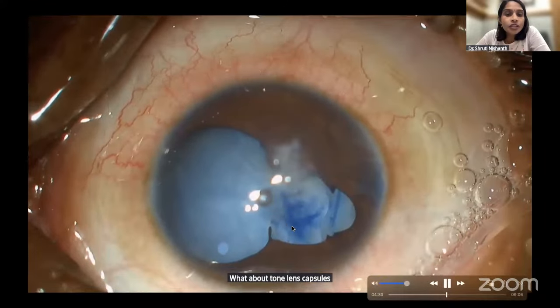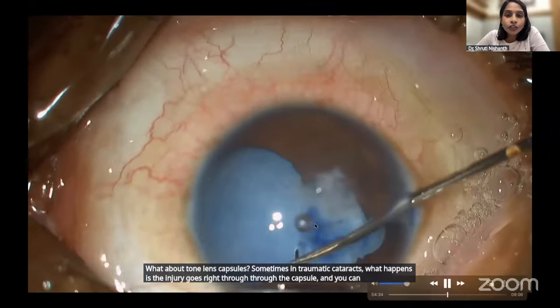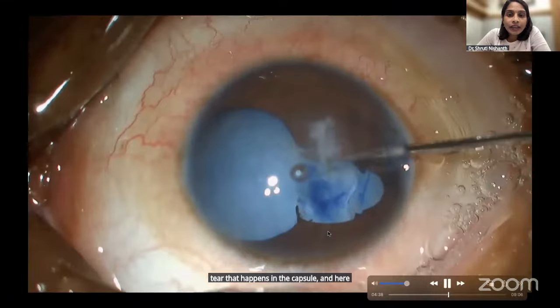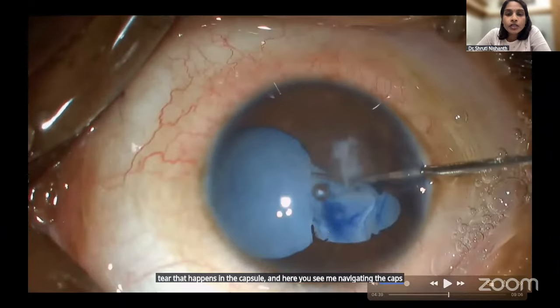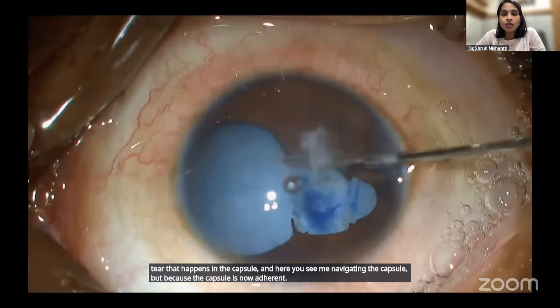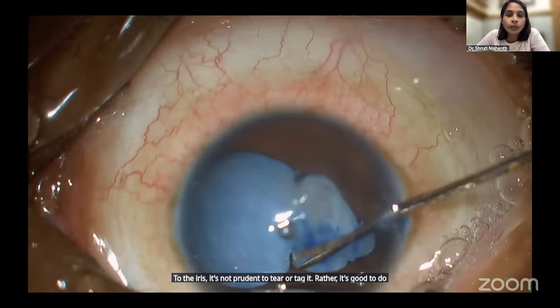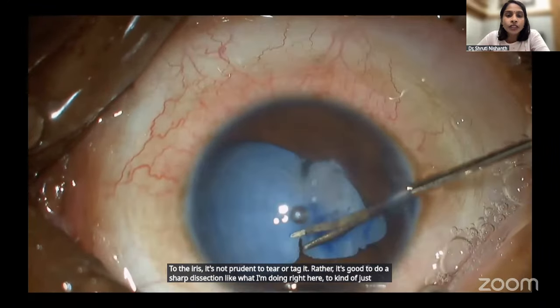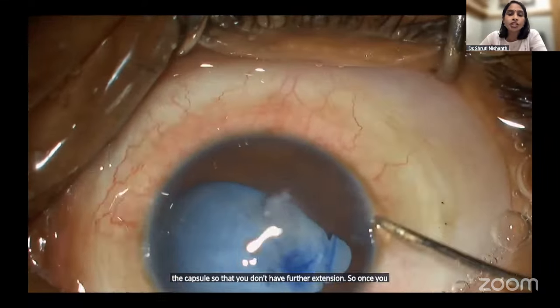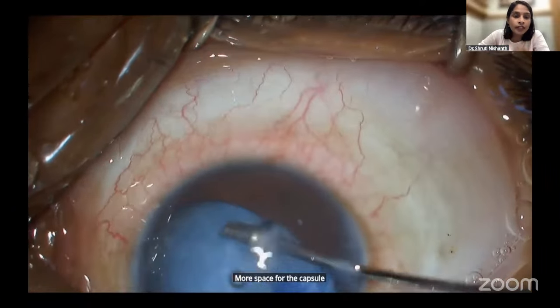Sometimes in traumatic cataracts, the injury goes right through the capsule, and you can see this kind of tear that happens in the capsule. Here you see me navigating the capsule, but because the capsule is now adherent to the iris, it's not prudent to tear or tag it. Rather, it's good to do a sharp dissection like what I'm doing right here to nick it off the capsule so that you don't have further extension. So once you have a sharp dissection, then you have more space for the capsule to give way as you do your rhexis.